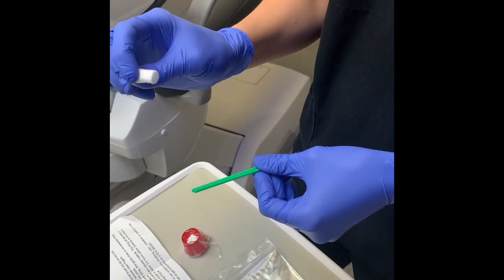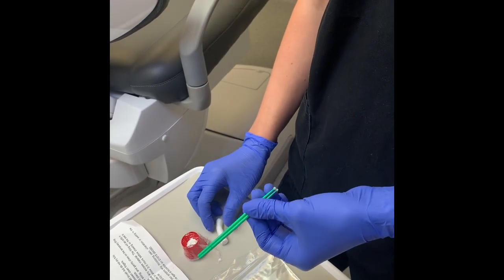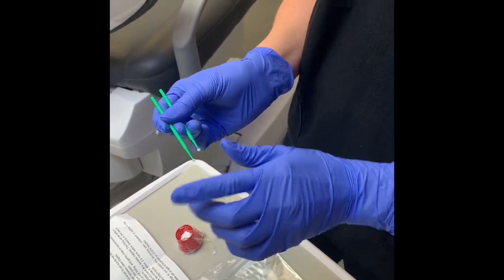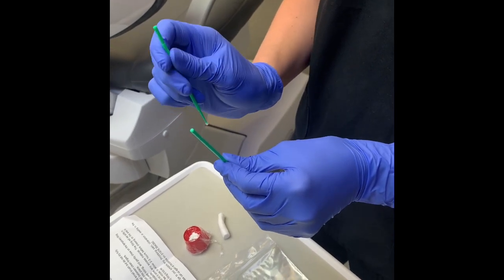Use these cotton wool pads to really bulk out your cheek so that everywhere is nice and dry and you can get good access to the tooth. These little instruments here are small brushes, but you can use the back of these brushes as a little instrument to help you pad in the filling.